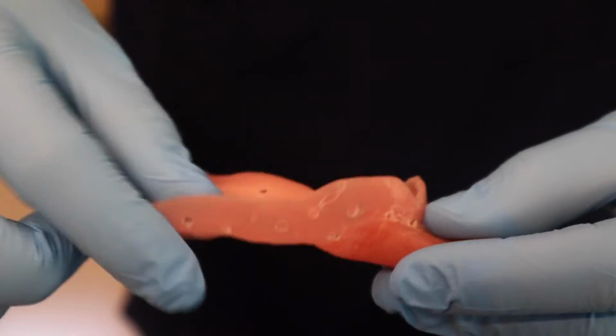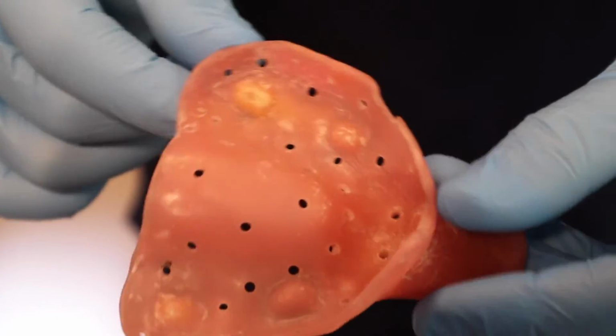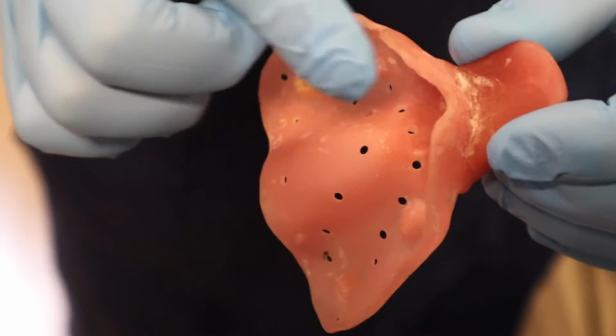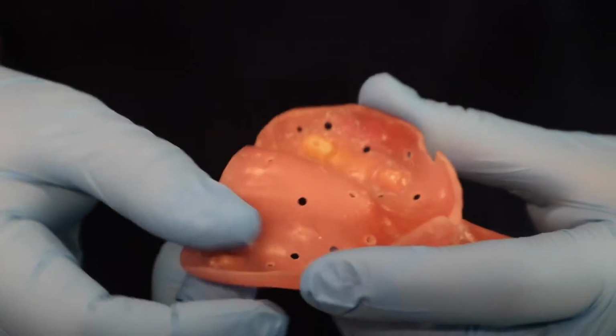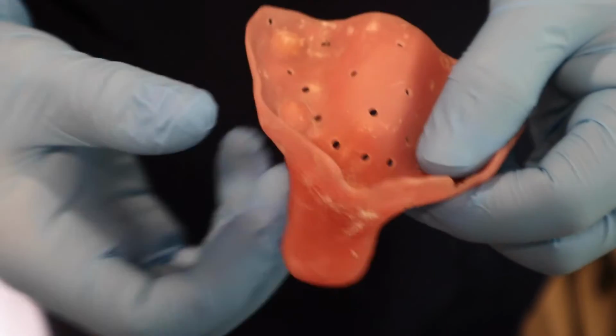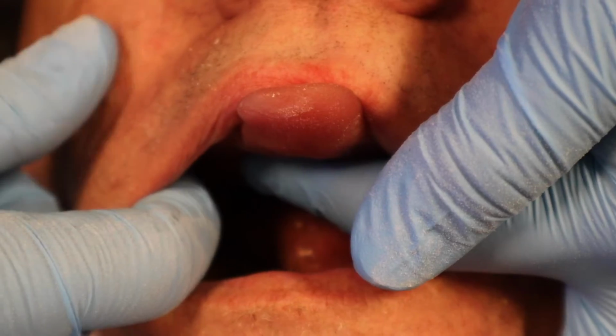So adjusting your custom tray so that it's not overextended, that it's not pinching on any of those frenums, any of that movable tissue, is going to make sure that you have a well-fitting denture. This is where it all starts, and I think this is where we often get it wrong right at the beginning. So I'm going to show you how I adjust all these areas of the custom tray.